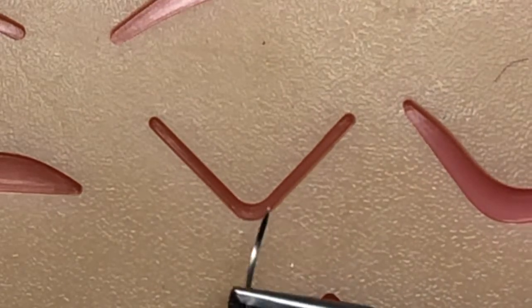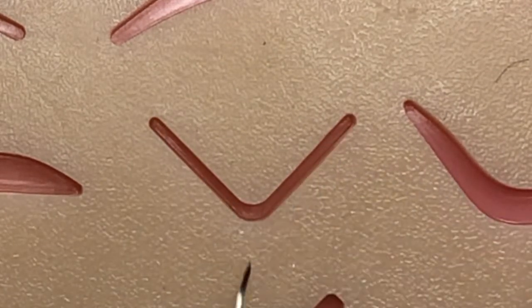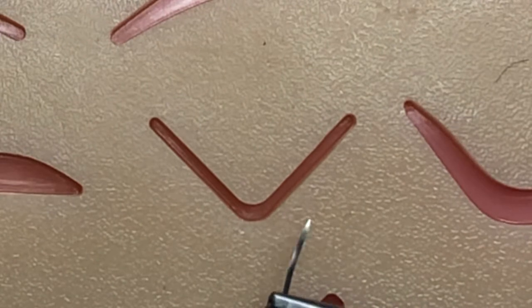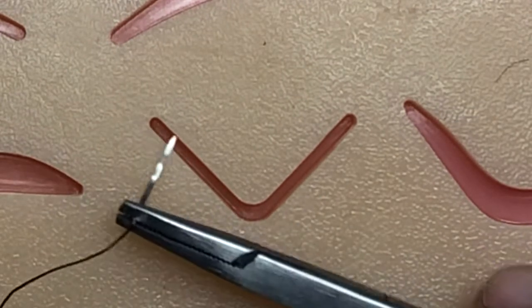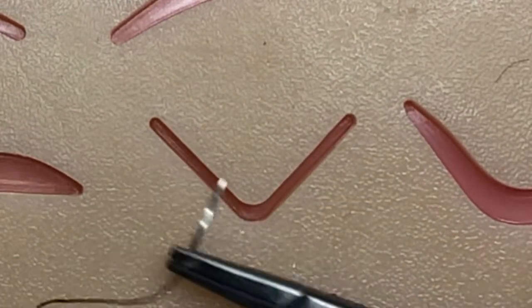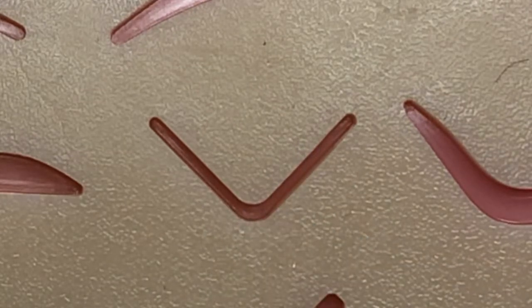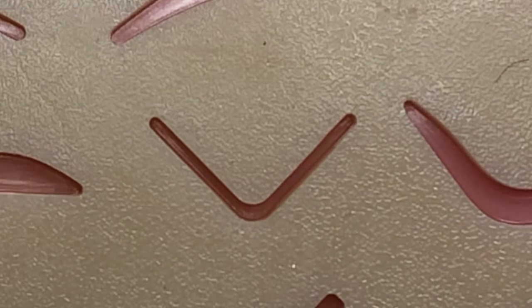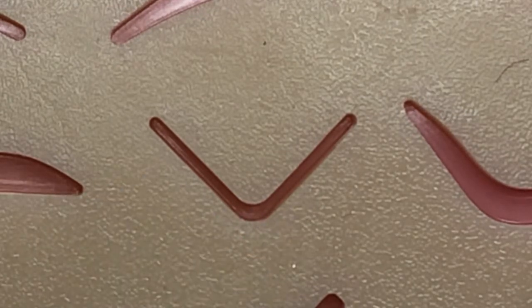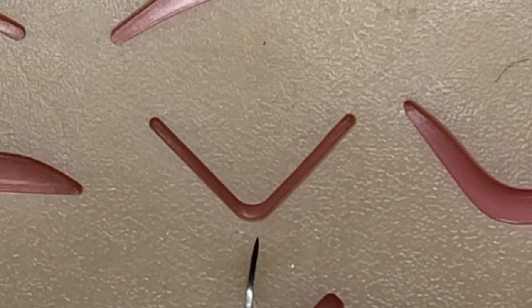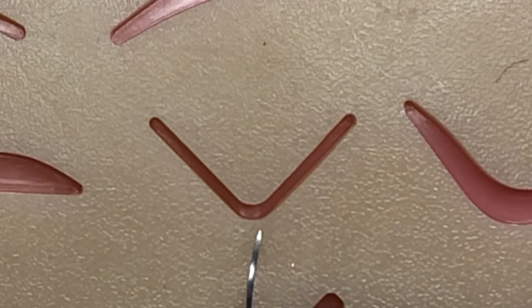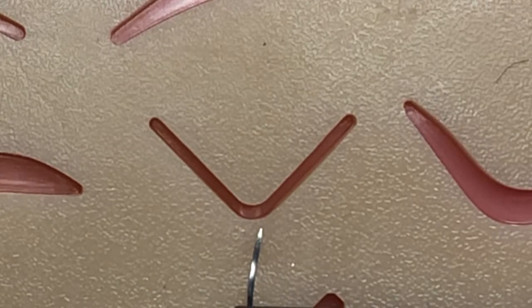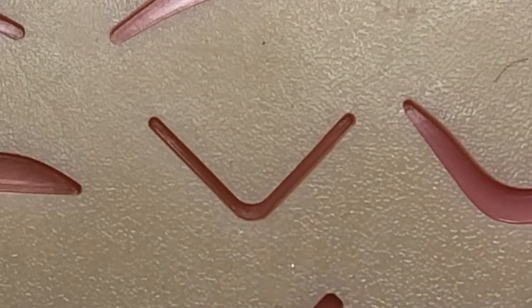With all tissue flaps like this, you got to be careful with your blood supply. This end piece of tissue, this flappy area right here, is not going to have as great of a blood supply as the surrounding areas. So you don't want to put so many needle sticks and needle punctures in here and put this under a lot of pressure, because you're going to end up strangulating that tissue.